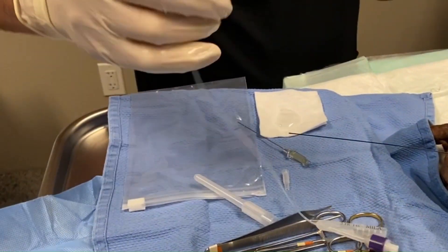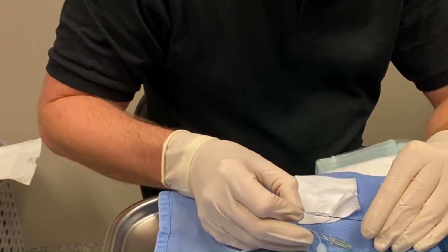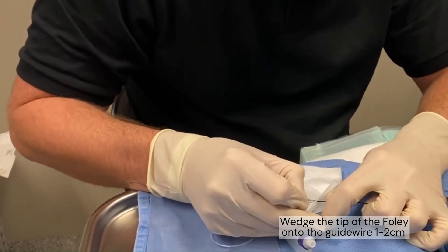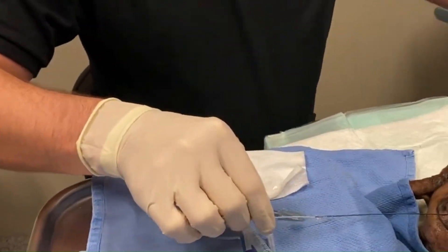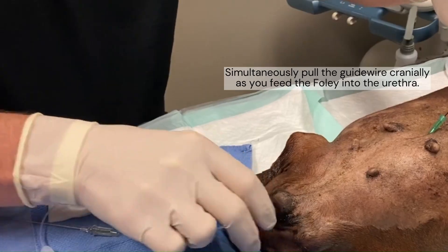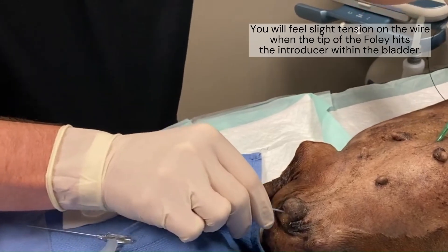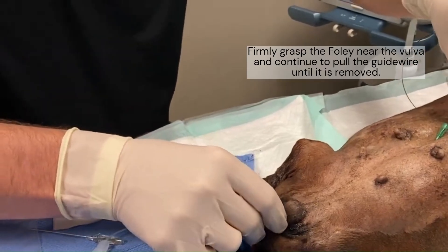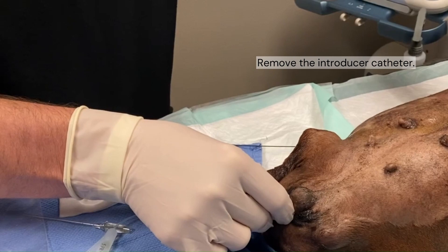Now I'm going to lubricate the catheter. We're using a 5 French, and I'm going to place it into the guide. I use friction — you can have this go all the way up, but I use friction. So at the same time, you're going to slightly push in and pull, and you'll actually see it hit over the needle guide. Then I'm going to hold the catheter, pull the guide wire out, and then pull the catheter out.